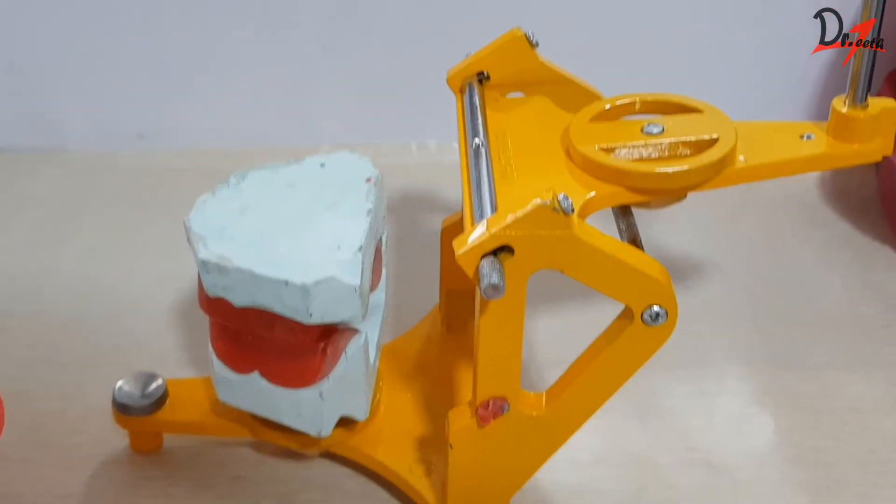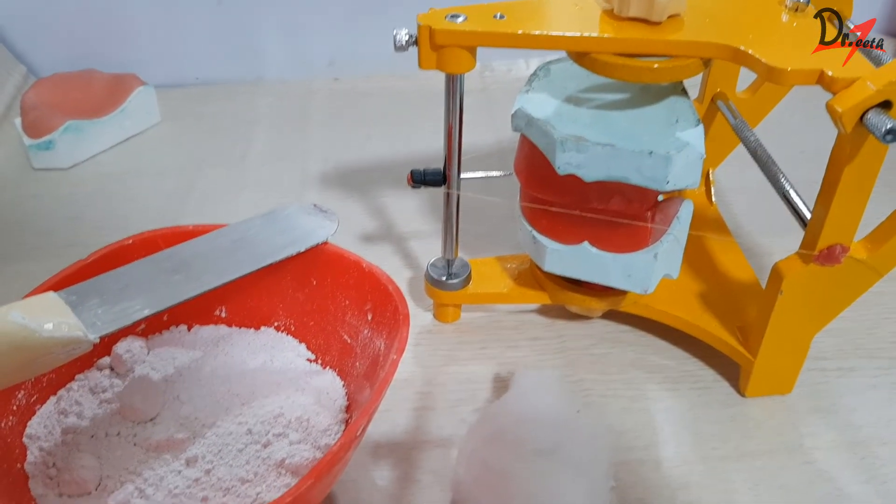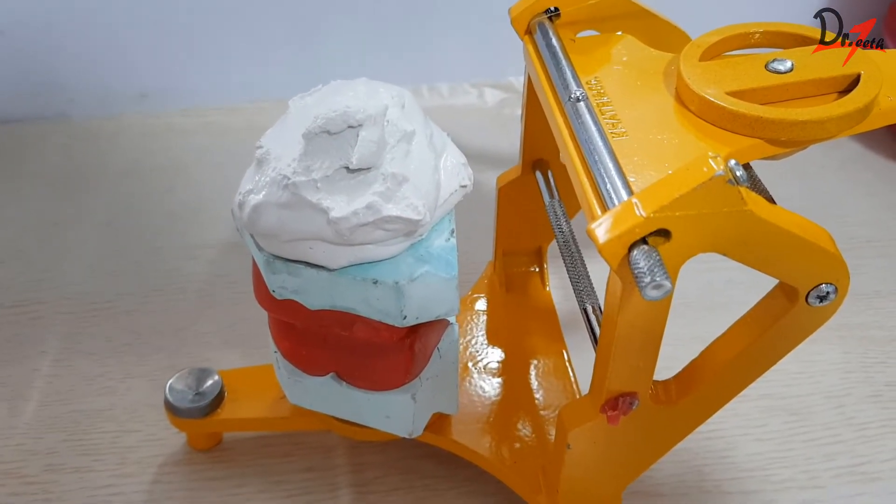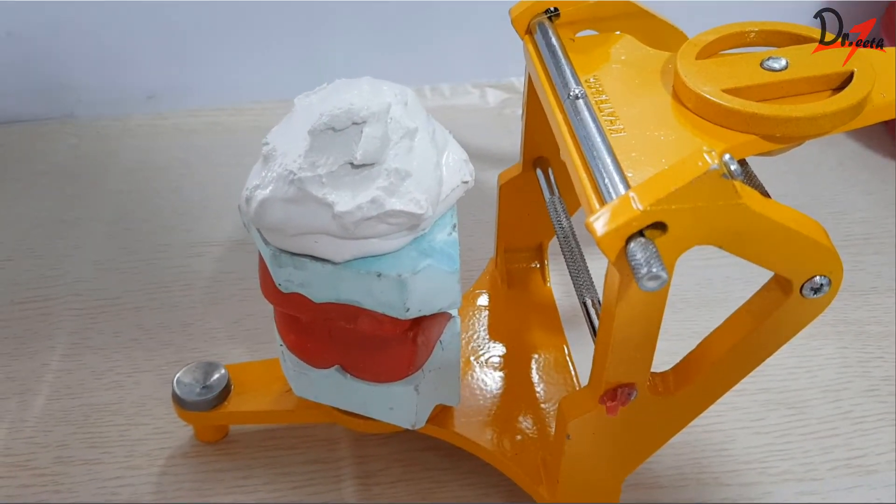Open the upper member and mix the plaster and put on the top of the upper cast. Make sure to put enough plaster so that when you close the upper member, the material should flow within the mounting rings. So, that will create retention.